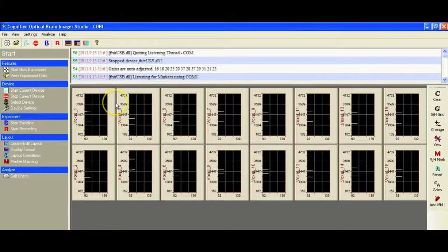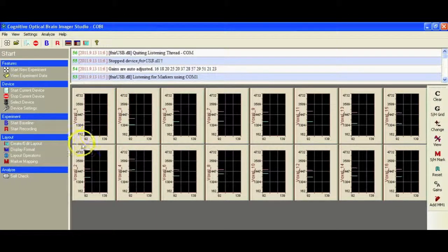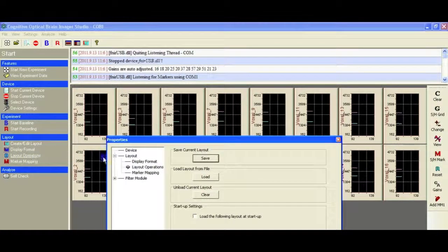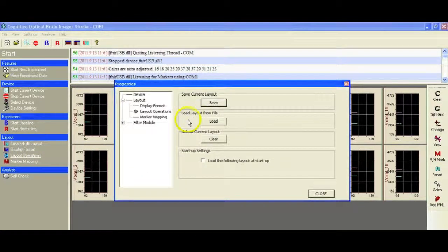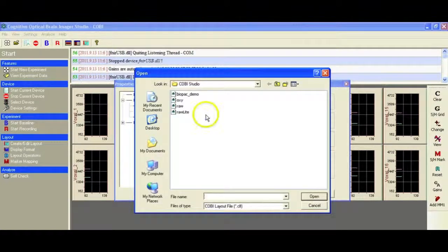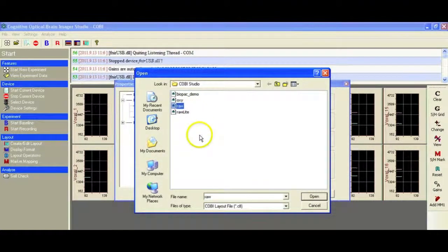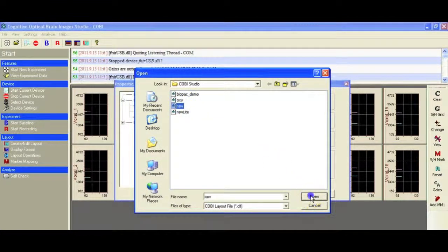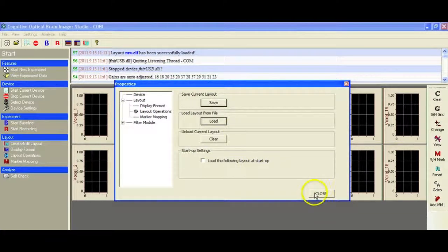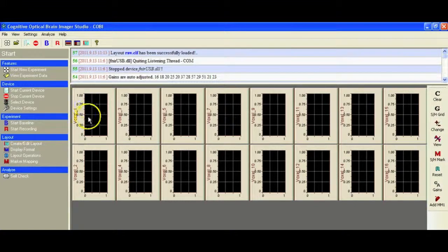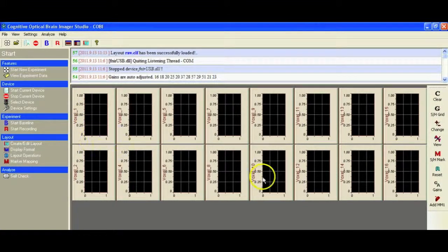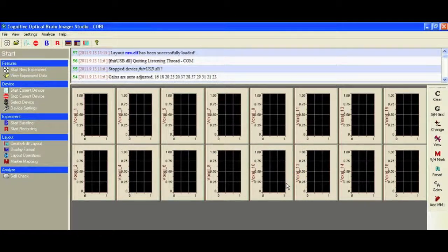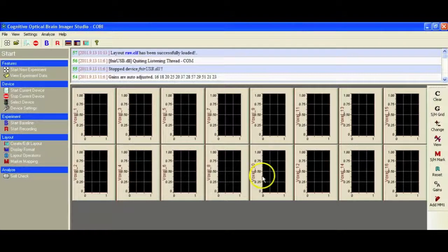Once you've selected your hardware, the next thing we need to do is go into the layout and we're going to pick the layout file, which for the purpose of setup is RAW. There are a few options in there. We select RAW and close, and then that gives us a view of each of the 16 channels, voxels 1 through 16.